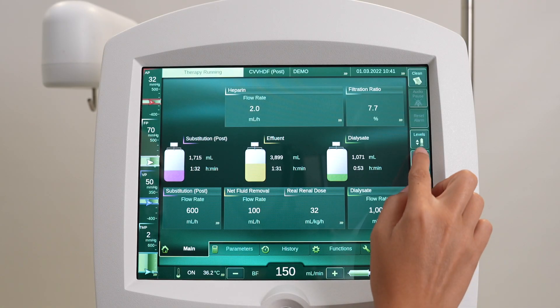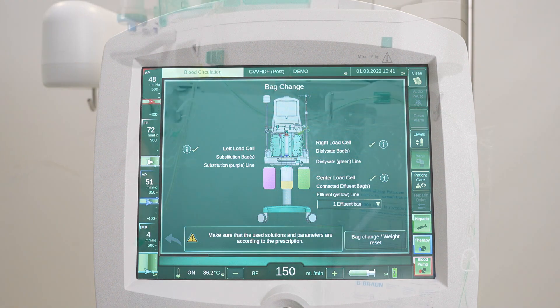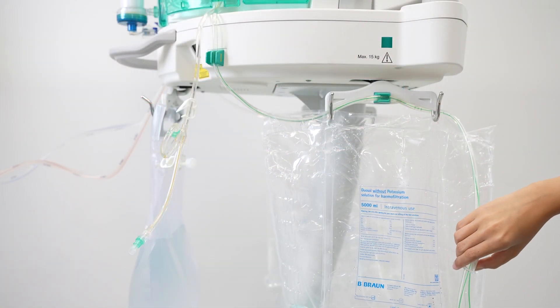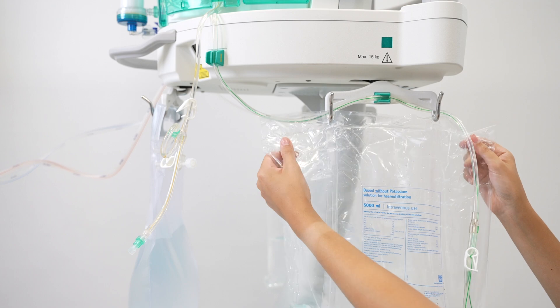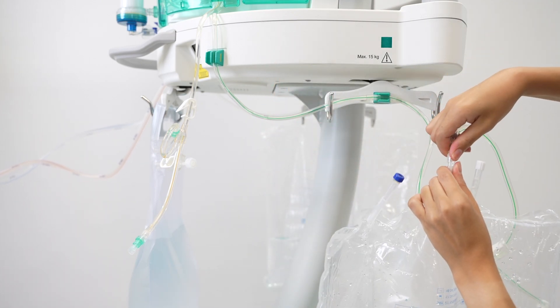To start the bag change procedure, press the bags icon to enter the bag change screen. Clamp the green dialysate line and unload the empty dialysate bag from the load cell. Disconnect the dialysate bag from the dialysate line.